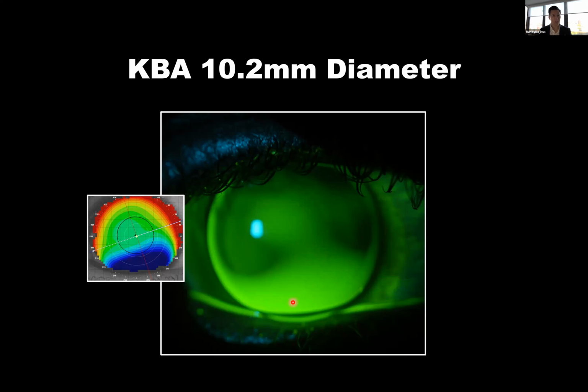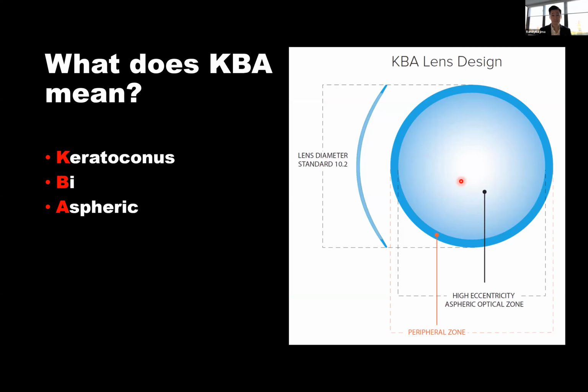So for this patient, we were lucky. The elevation differential wasn't too high. The lens didn't catch the lower lid and want to pop out, maybe because the height difference wasn't so great. The lid is holding the lens up. It's tucking the lens underneath the lid, so there's less lid interaction with the edge of the lens. It was a successful corneal GP fit.